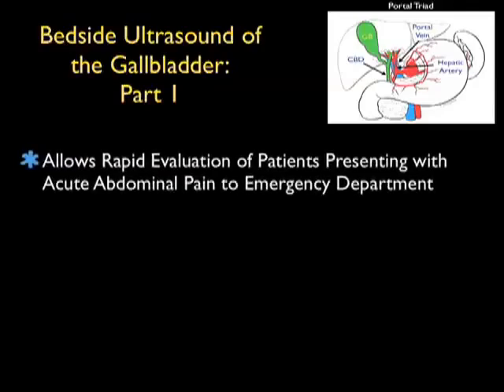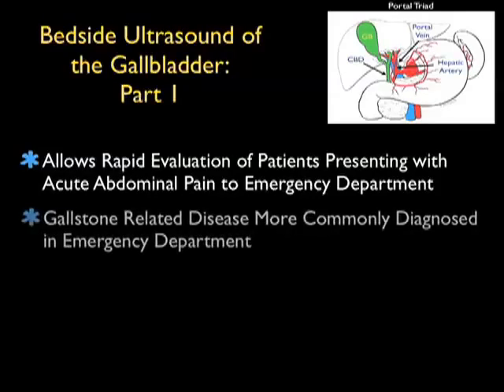In this SoundBites module, we're going to focus on bedside ultrasound of the gallbladder. I've divided this module up into parts 1, 2, and 3, and in this module, part 1, we're going to focus on the normal hepatobiliary imaging and ultrasound findings.